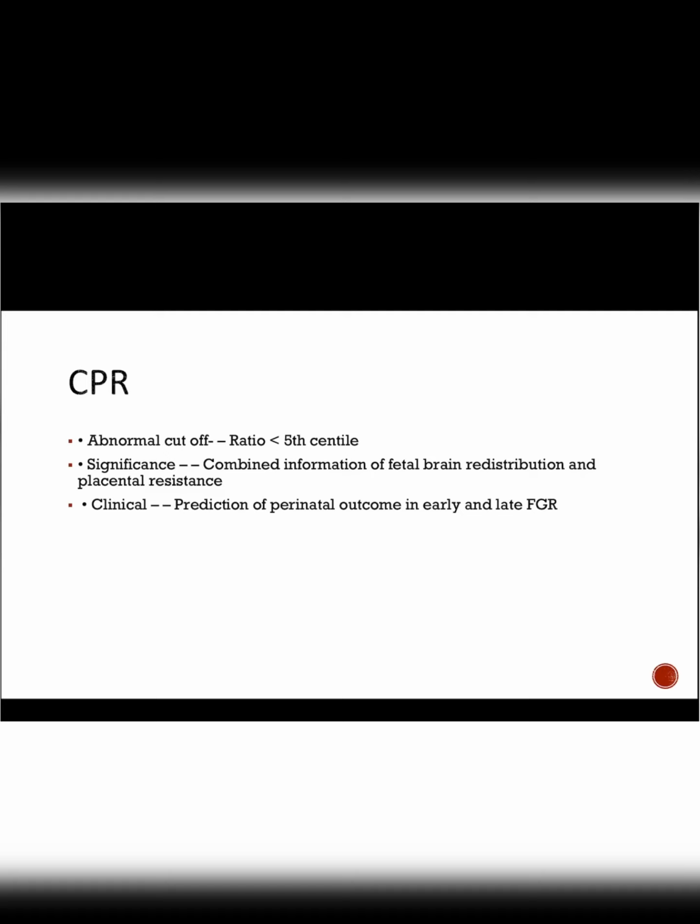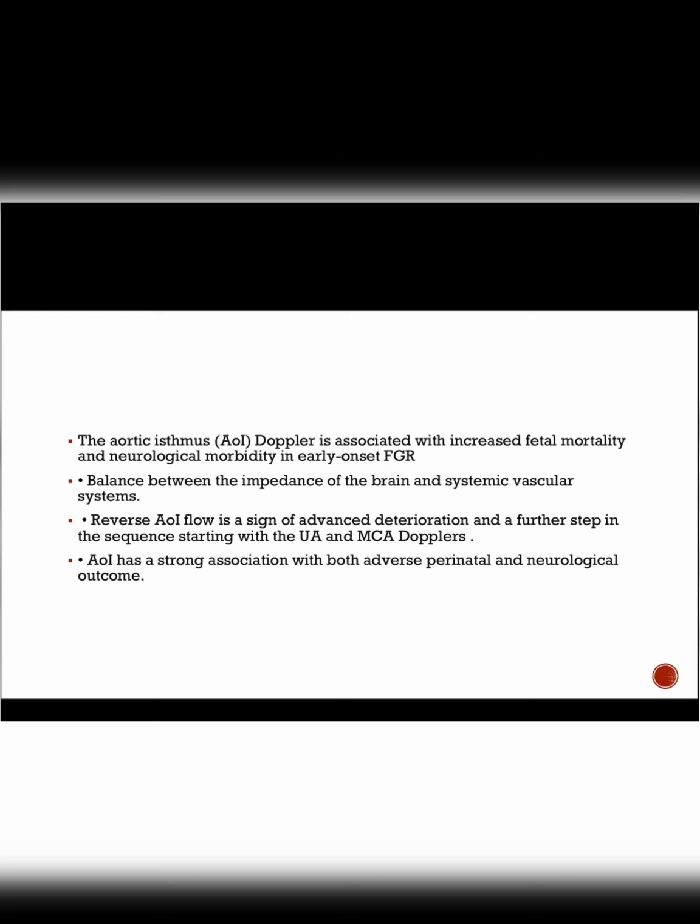So abnormal CPR, anything less than the 5th centile is an abnormal CPR. Significance: it gives combined information of fetal brain and placental resistance. So we have covered that. Now come to aortic isthmus Doppler. This is more of theoretical.